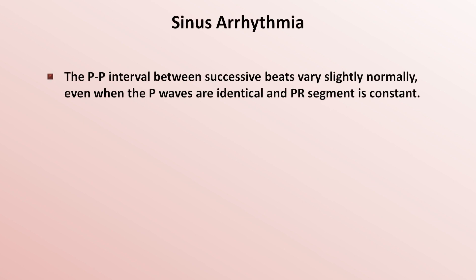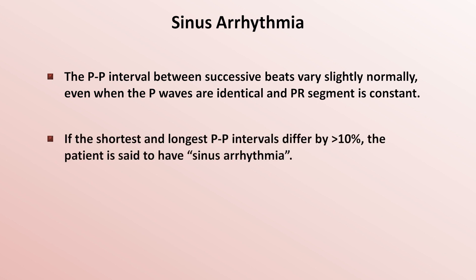First up is sinus arrhythmia. The p-to-p interval between successive beats normally varies slightly, even when the p-waves are identical and the PR segment is constant. However, if the shortest and longest p-p intervals differ by more than 10%, the patient is said to have sinus arrhythmia. I've seen a few different definitions out there, but this one seems to be the most common.